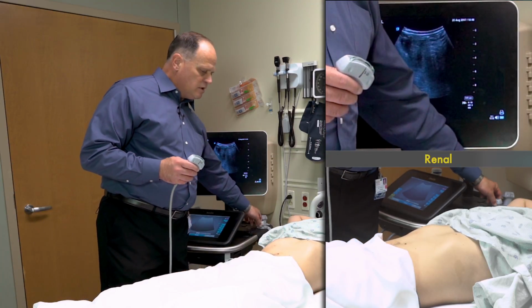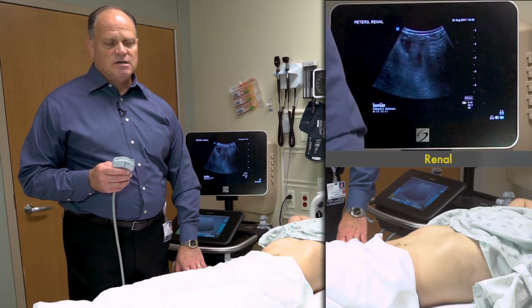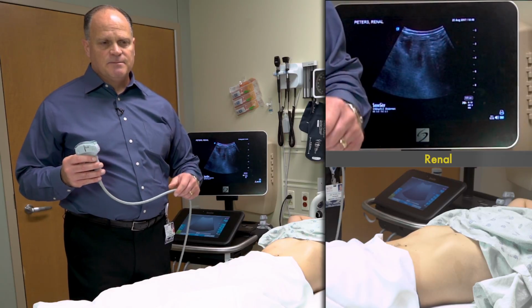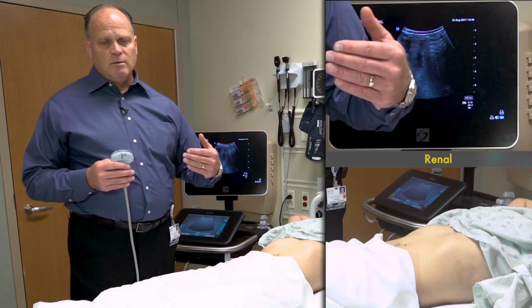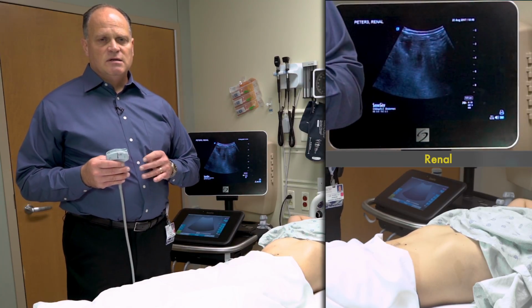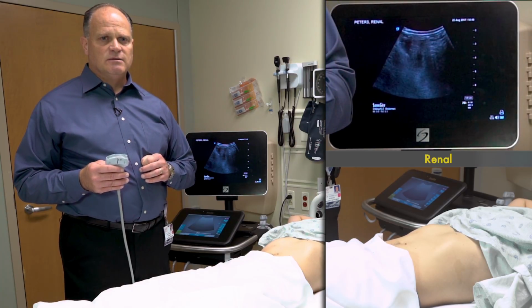Most of the time, you can also get images from the sagittal view in patients. However, the more bowel gas that's present, the more challenging that becomes. The other thing that we can do to improve our views is have our patients roll into a right lateral decubitus and a left lateral decubitus position so that we can see the kidney and image it from the posterior aspect of the patient as well.